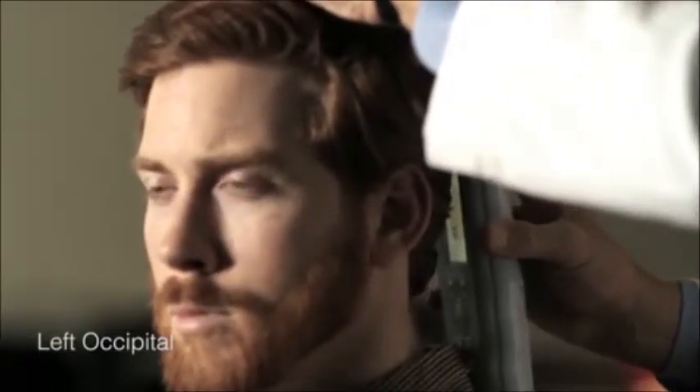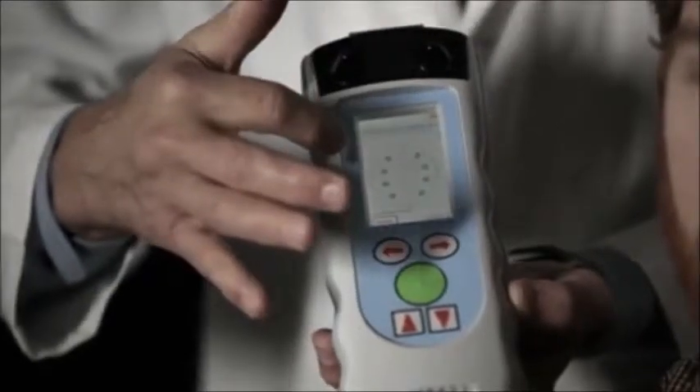We're going to complete the last measurement in the occipital area. We select a line between the top of the ear and the back of the skull, midway between that spot. We again get through the hair, then the same point between the top of the ear and the external protuberance of the skull midline. We now have an absolutely normal scan bilaterally in all eight areas — four on each side.